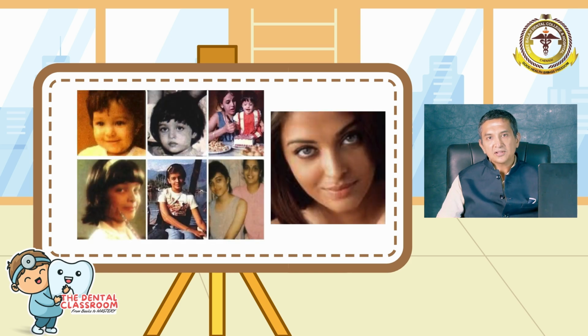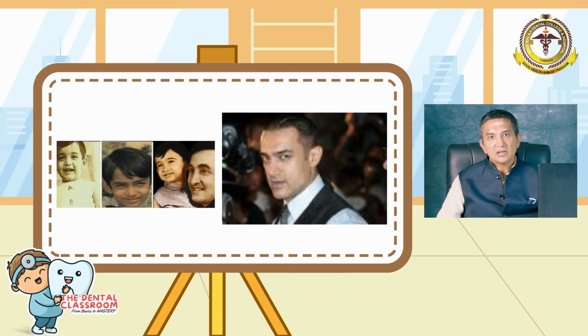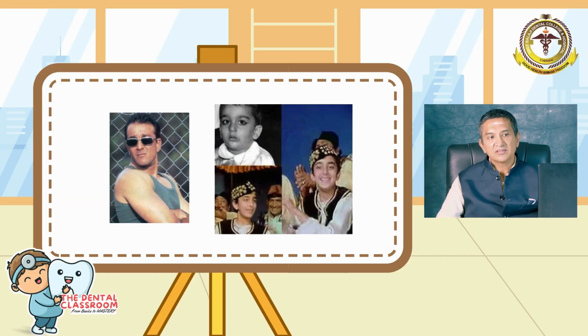So we saw that it can predict growth. When you take a photo of a young individual like this, we can use the cephalogram to predict the growth, not necessarily as they show in the movies, but we can predict how much the cranial base will grow and how much the maxilla and mandible will grow.